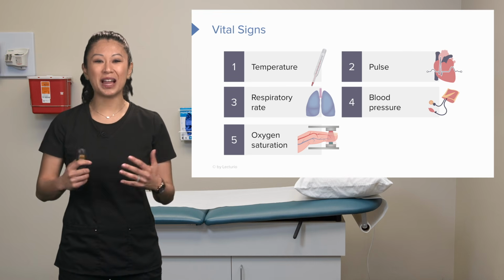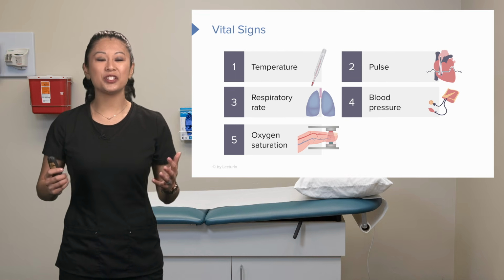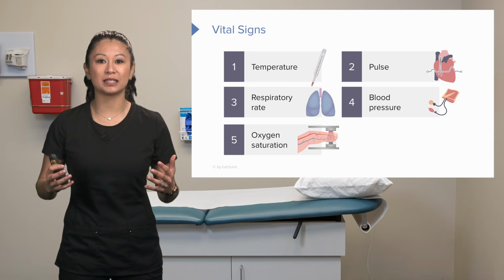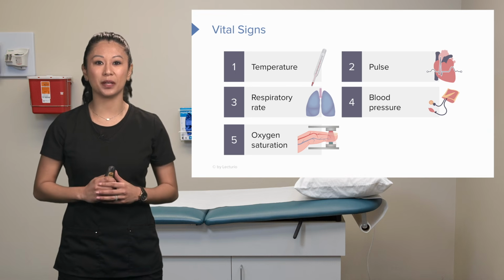So these big 5 components is what we call a full set of vital signs. As you can see, these are hitting many different areas of the body and our body systems, so it's going to give us a really great indication of how well your patient's doing.